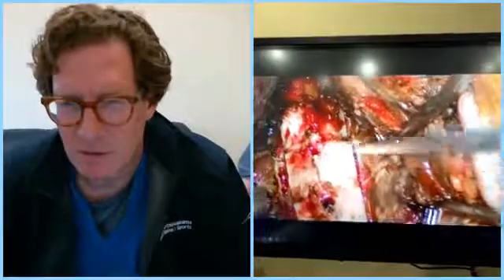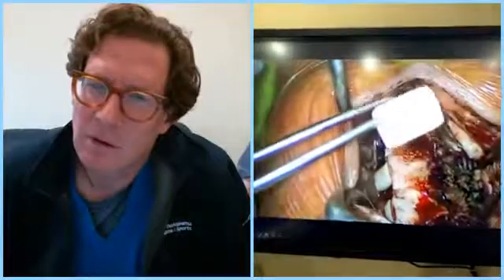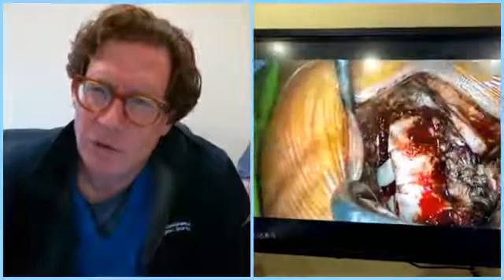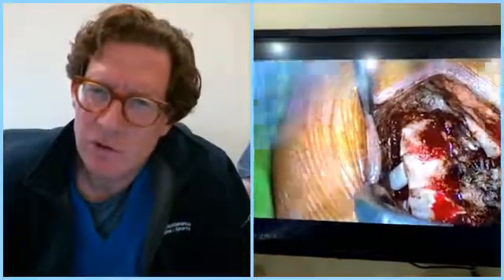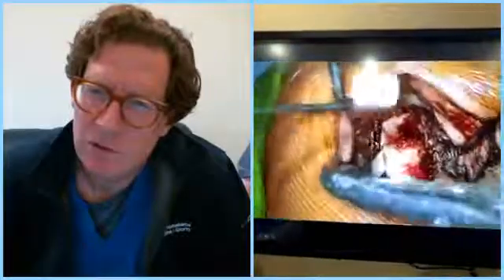Now the bone is so thin I can bend it. And then what we're going to do is take little spacers. And by the way, notice how small the incision is. This is my fingers in front of the incision. It's about 1.5 inches versus about 10 inches. So we're going to take a little hook. We're going to take those bones that we have sculpted and reshaped. We're going to lift them up, put a shim in, and it's kind of like opening up a drawbridge and then putting a piece of structure in to hold the drawbridge in place.